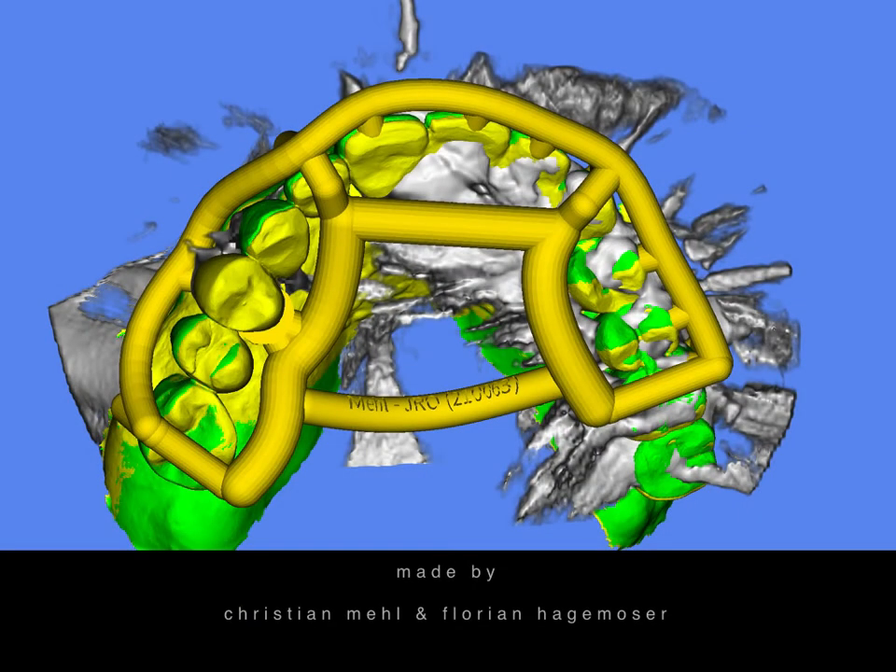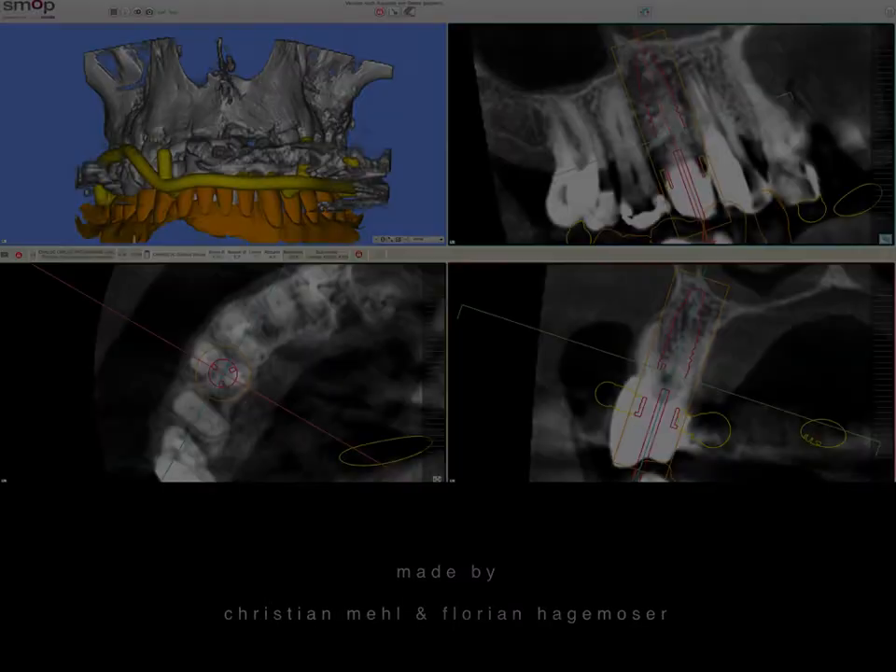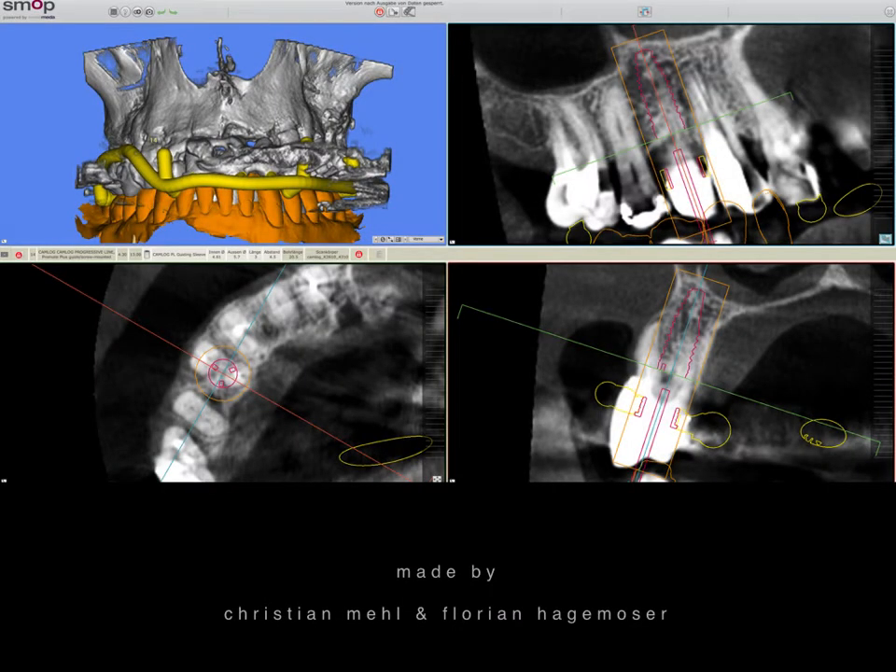Then we produced the guide. The implant planning positions the implant slightly palatally between the roots to make sure that we don't have any recession risk.